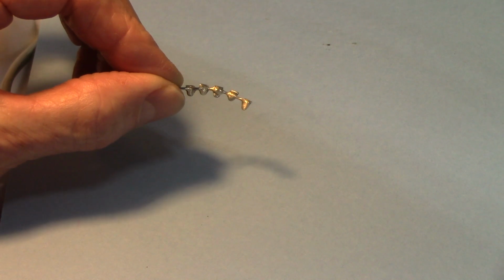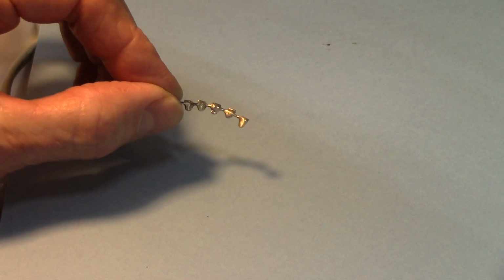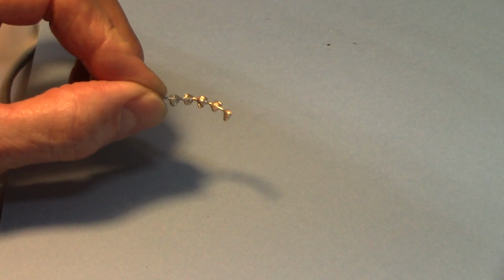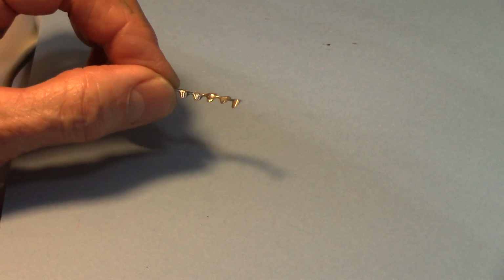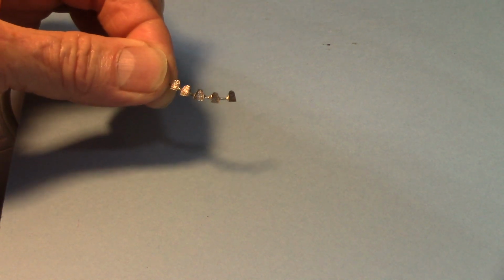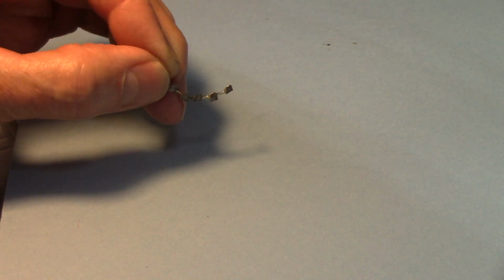So I've dissolved the flux, and I took a stone and kind of shaped up the solder joints, got some of the bulk off, and I'm not done with this. I got to do a little bit more shaping, and then I'm going to polish it up. Got to micro etch the bonding surfaces of the pads.